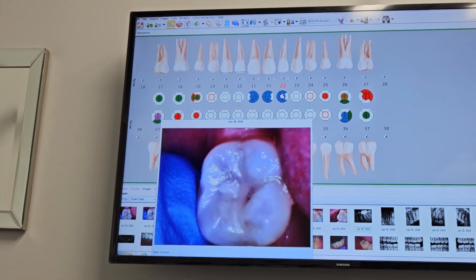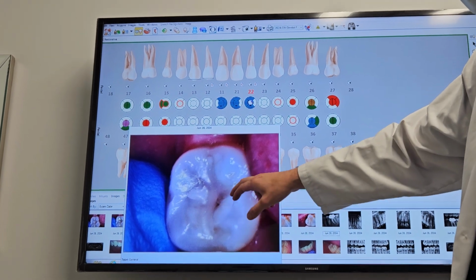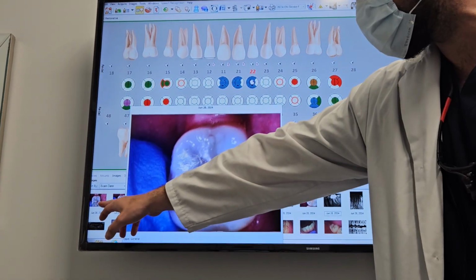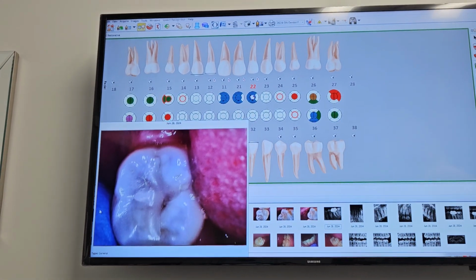Because you caught it shallow. Exactly. And the thing is here, this is not shallow because you had a filling here, but look how dark it is underneath it. You can really see it. Go to the next photo. You can really see it again. This looks normal. This doesn't. So this is going to be a big one. I got you. Okay, got it.